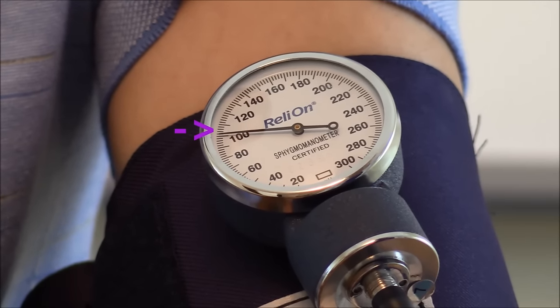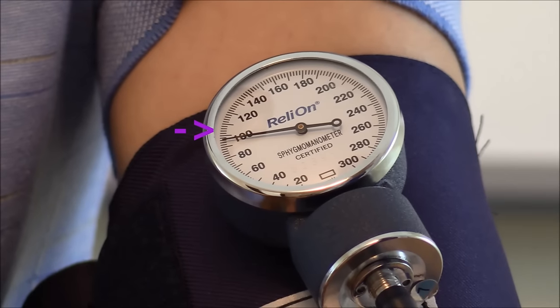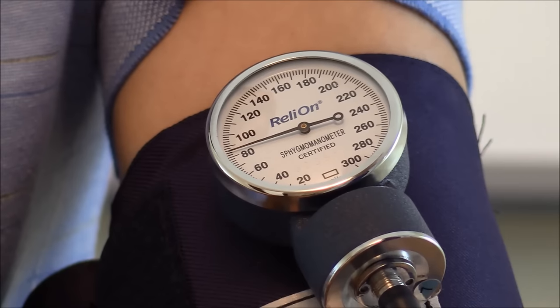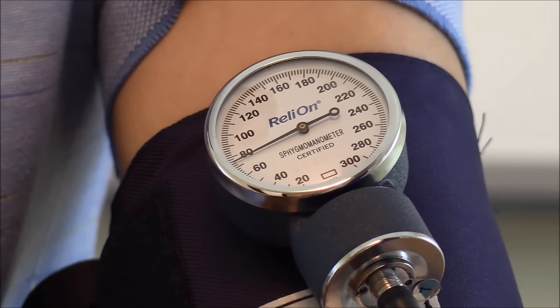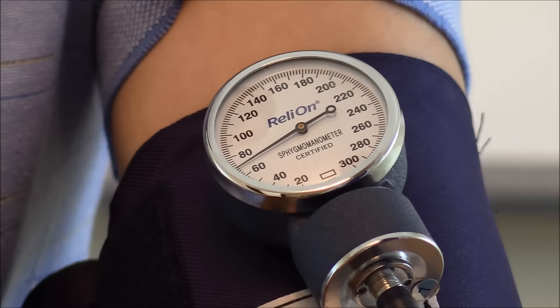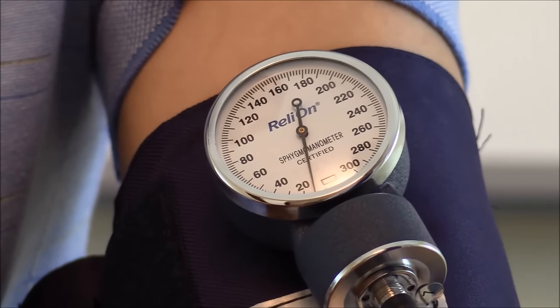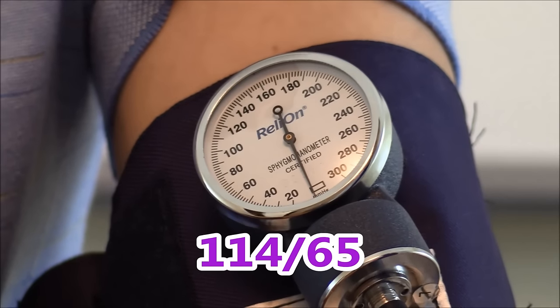Okay I heard it at about the 114 mark. Now we're listening for whenever it stops and whenever it stops that's our diastolic. Okay it stopped right at 65 so his blood pressure is 114 over 65. So that is how you check vital signs.